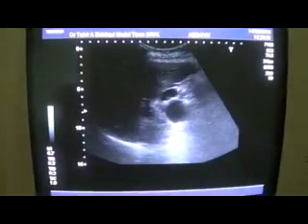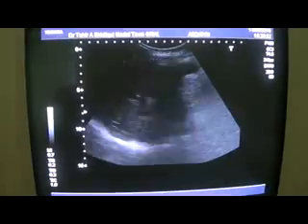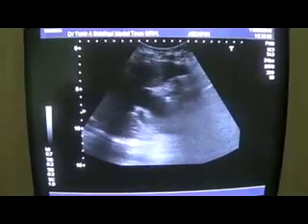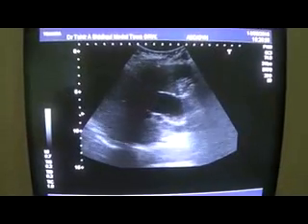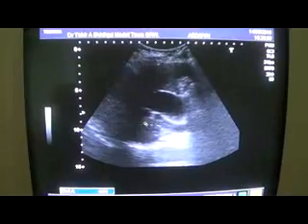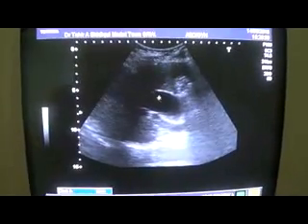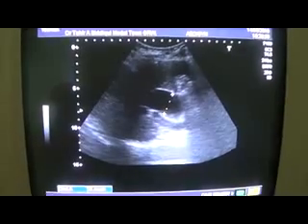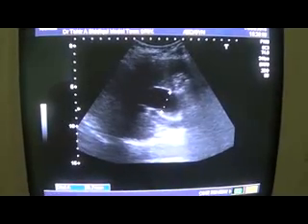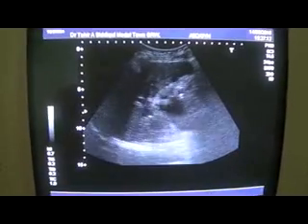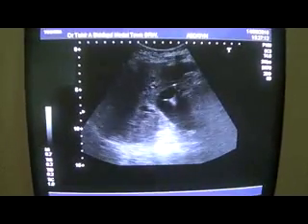What I am going to show you straight away is the dilated common bile duct in the case of obstructive jaundice. This is the portal vein and this is the common bile duct. Let's measure it — it is dilated up to 26.7 mm. Significantly dilated.